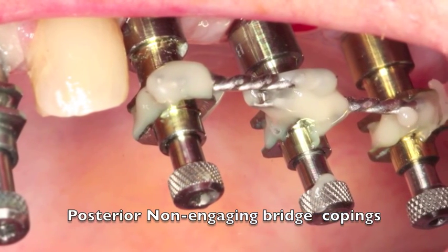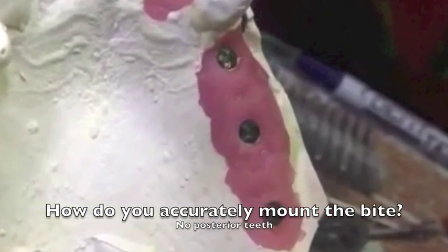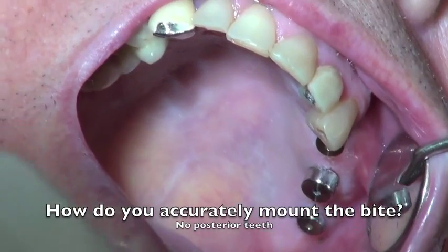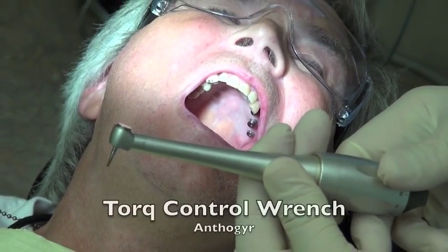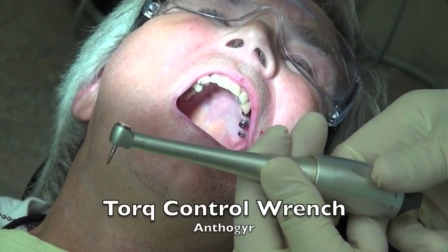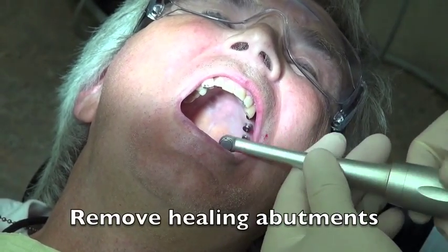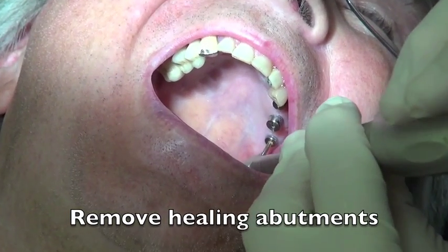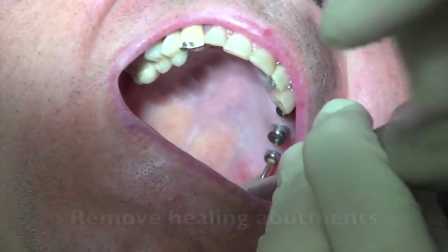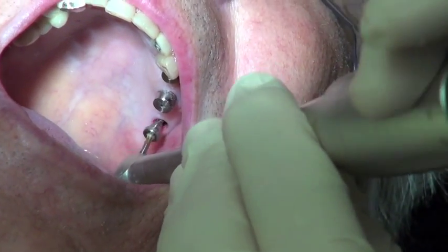The impression was then poured up and we had to mount the bite. This video is going to show you how we mounted this to get an accurate bridge impression and mounting. So we took a torque control wrench, which is a fantastic tool to have. You can dial up your torque and put bridges on and off. Our first task is to take the healing abutments off — you can go back to the posterior aspect of the mouth and easily get these off by just twisting in a counter-clockwise fashion.